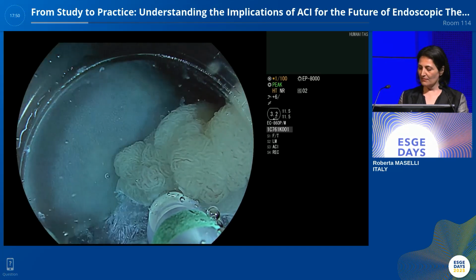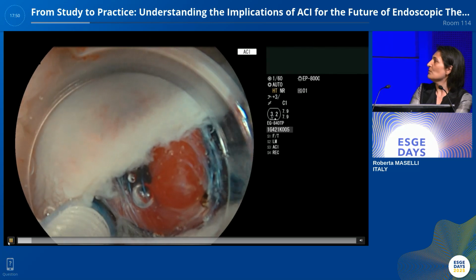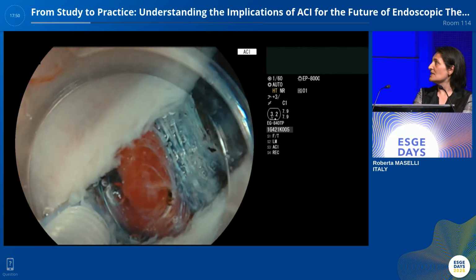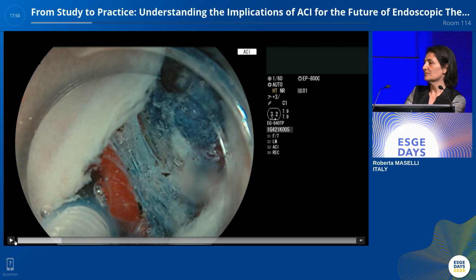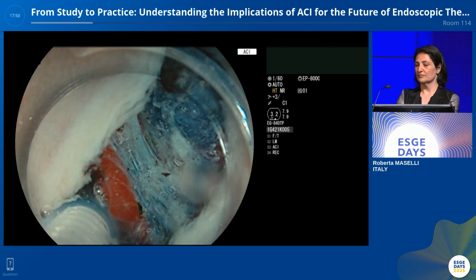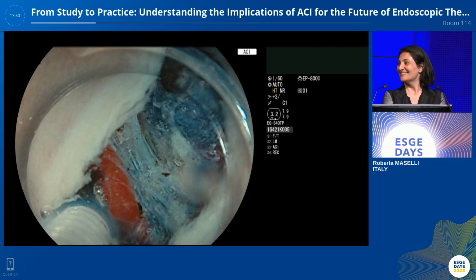Last video, and even here, as Edward showed, I have a bleeding. See these very big vessels. We are already on ACI. Can you stop on it just one second? Who is going to use a coagrasper now? Please raise your hand. And who is going to use the bipolar forceps hemostat? Nobody. Oh my God. Any comment on this vessel?